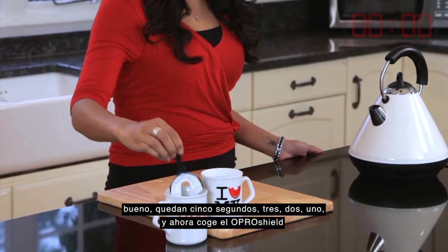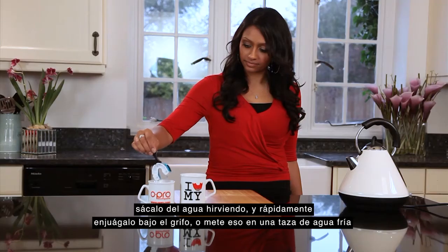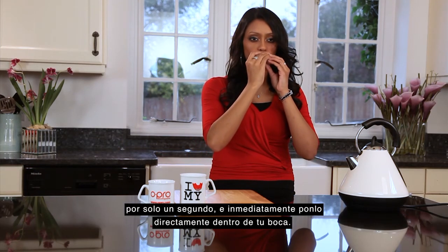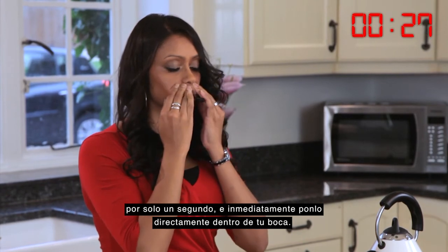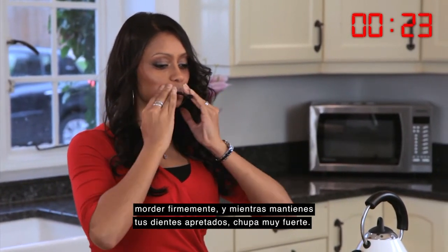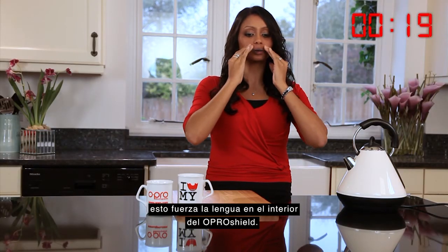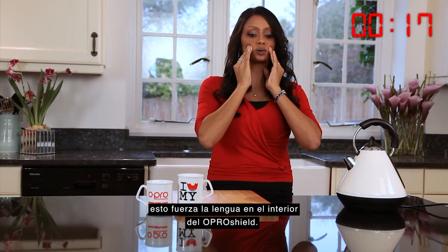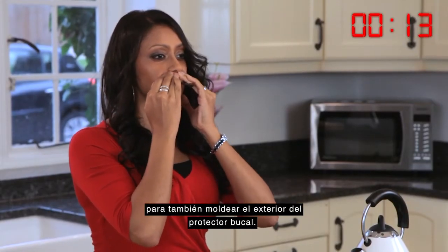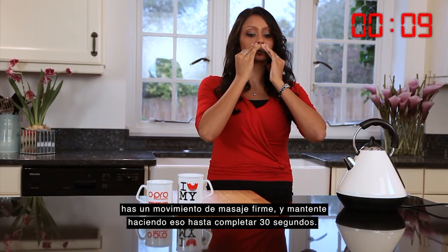Take the OproShield out of the boiling water, and quickly rinse it under a tap or dunk it in the cup of cold water for a single second, and immediately pop it straight into your mouth. Bite tight together, and while holding your teeth tight together, suck very hard. This forces your tongue into the inside of the OproShield. Keeping your mouth closed, force your fingers around your lips to mould the outside of the mouthguard as well. Use a firm massaging movement, and keep it going until the 30 seconds is up.